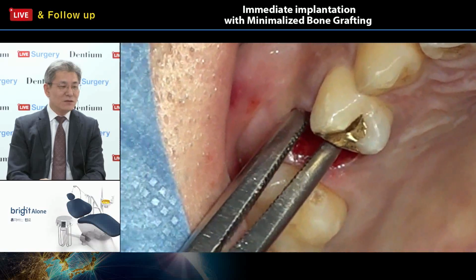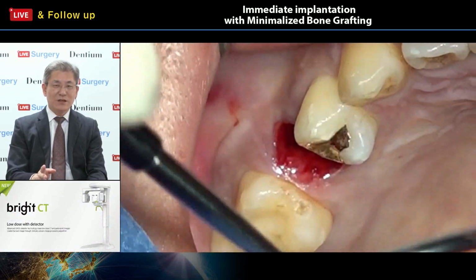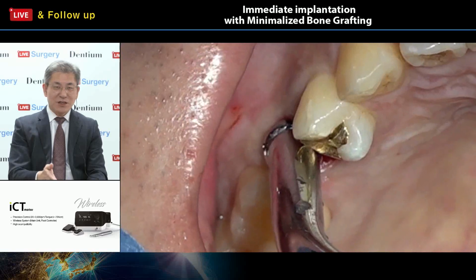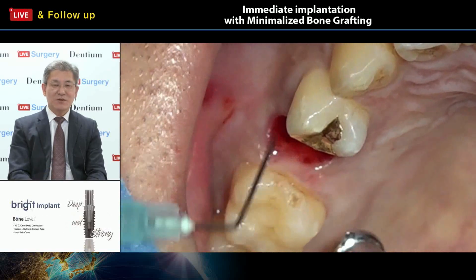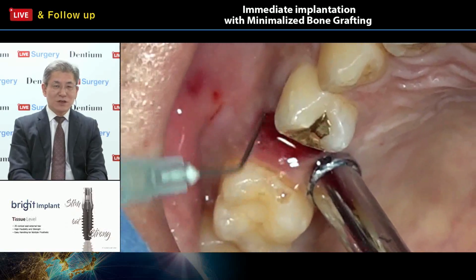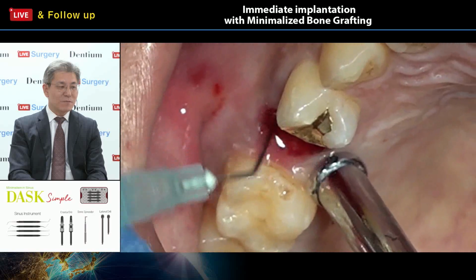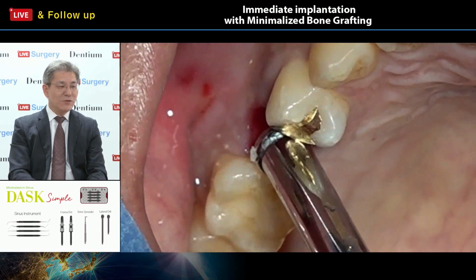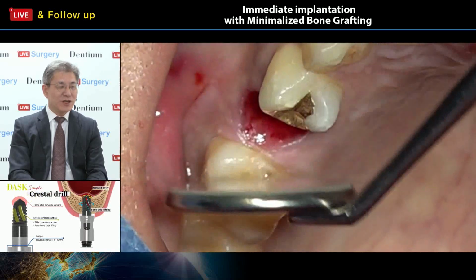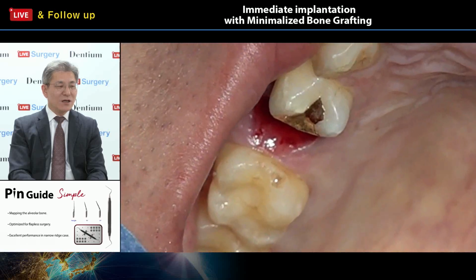If the premolar is two-rooted like this, sectioning by using a high-speed taper fissure bur is also a good option for removing these teeth. But anyway, all the remaining root tips should be extracted safely, and then checking again.